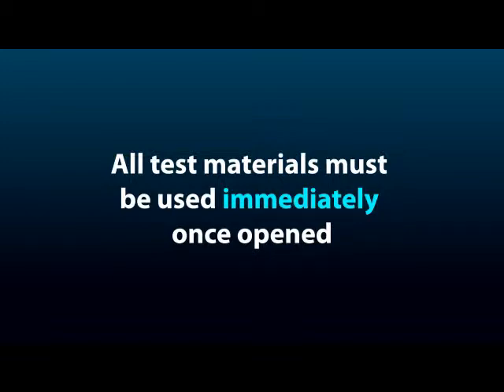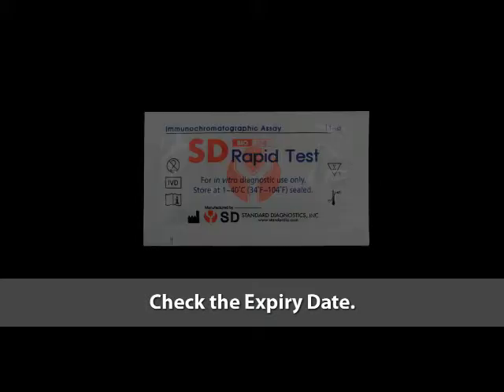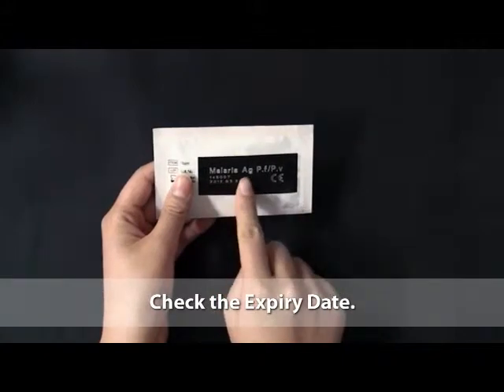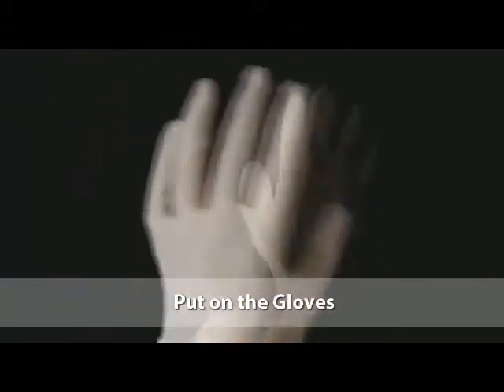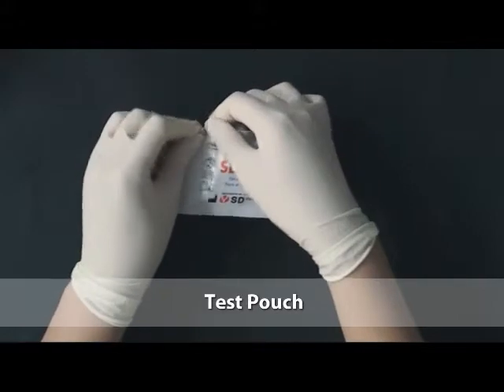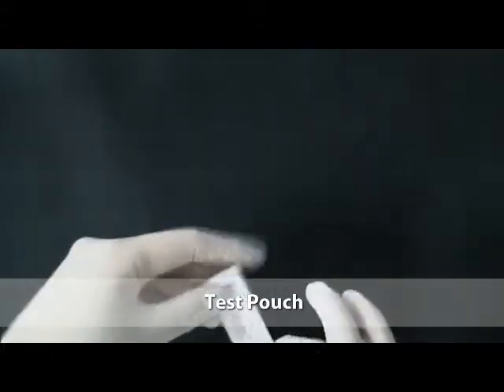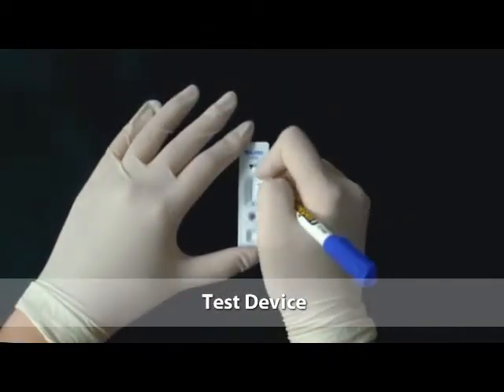Let's begin the test. Check the expiry date on the back side of the test pouch. If the expiry date has passed, use another kit. Put on the gloves. Remember, use new gloves for each patient. Open the test pouch and set the test device. Write the patient's name on the test.